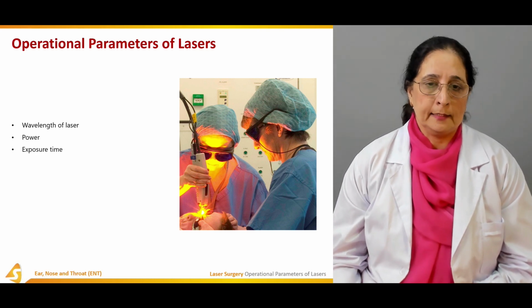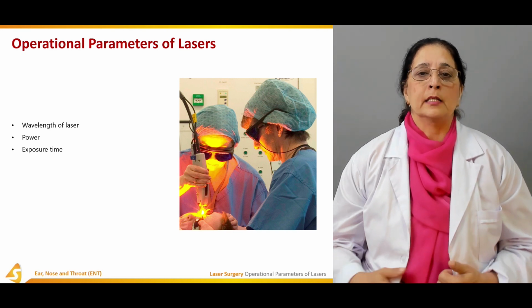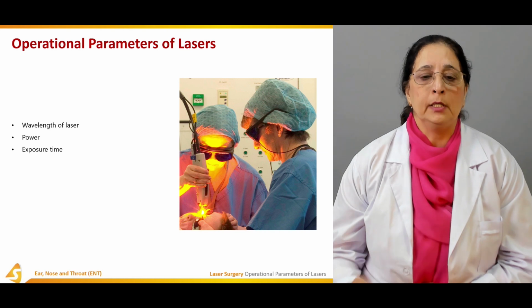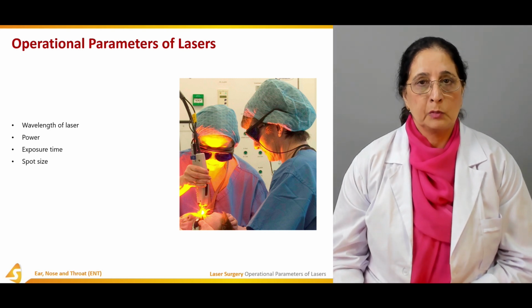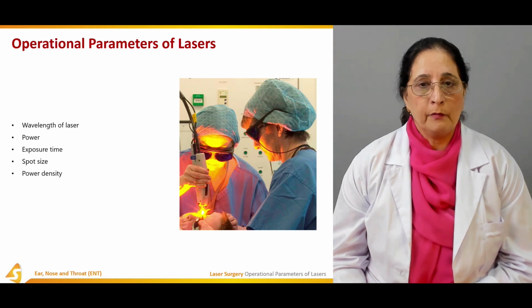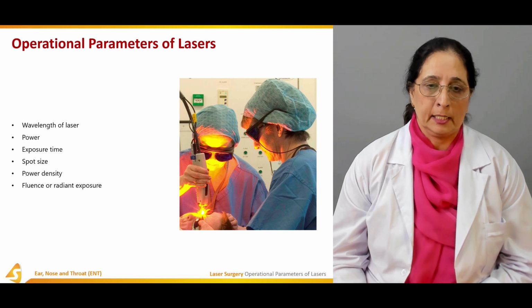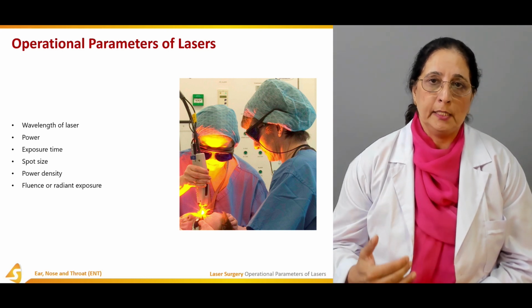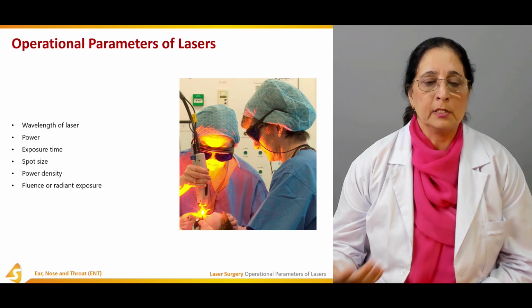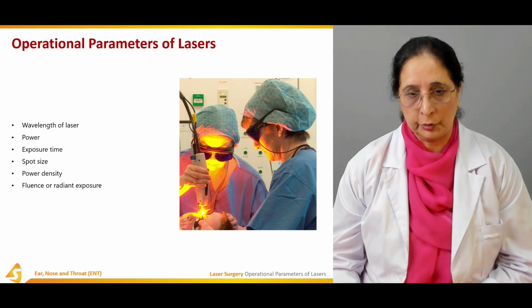Power of the laser, exposure time, how long we are exposing the tissue to the laser. Spot size, big or small, and power density, fluence or radiant exposure. We will go over these terms one by one also. What's the power density? What's the fluence or radiant exposure?